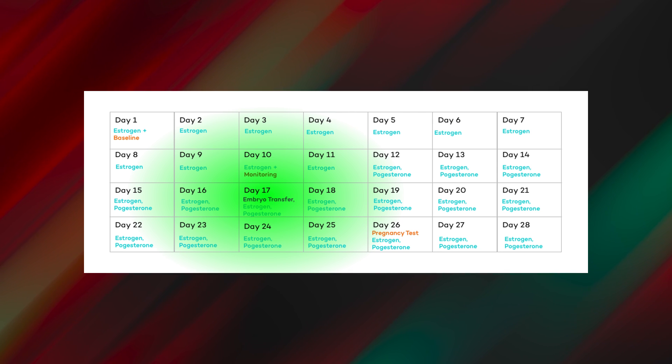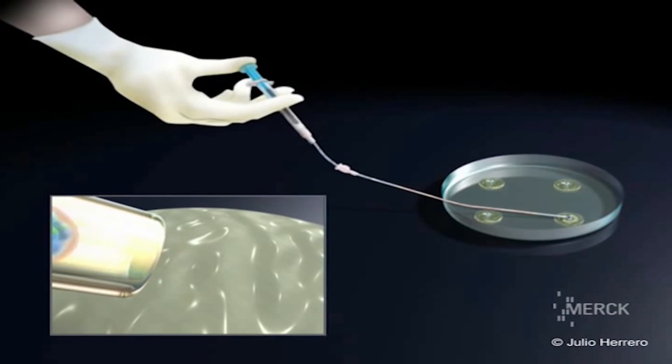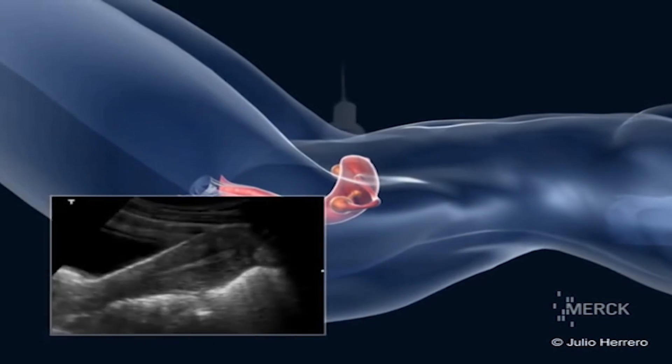The embryo transfer is a straightforward process. The embryos are loaded in the catheter and transferred into the female uterus.